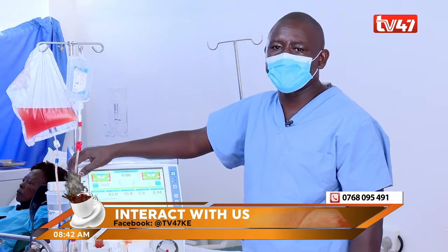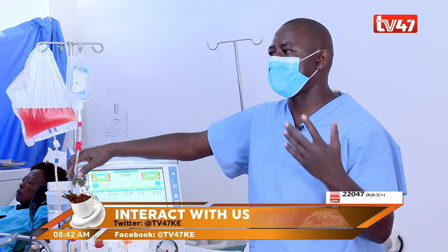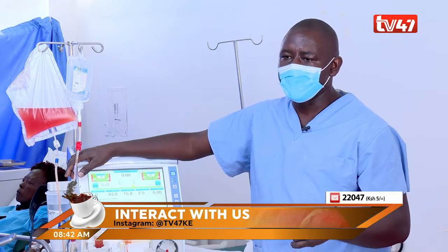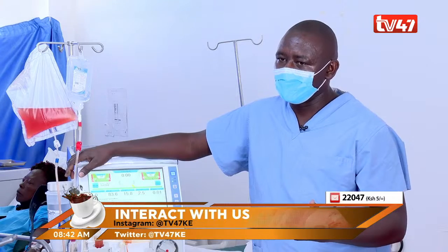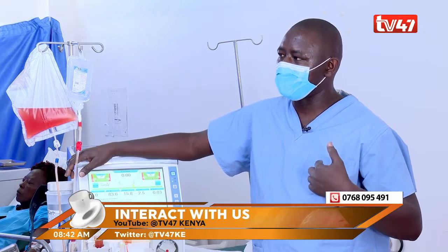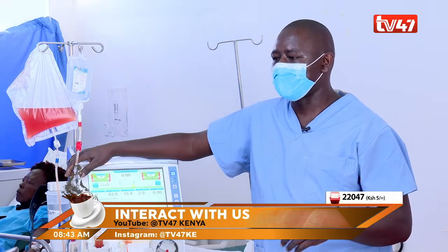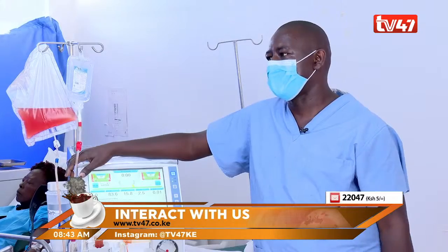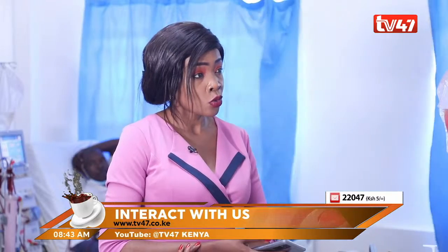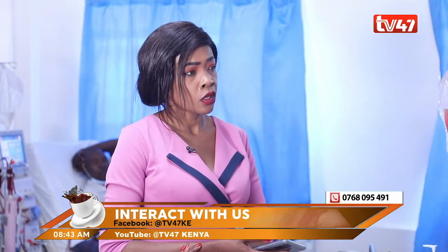When a patient is recommended by a doctor to do dialysis, first we usually encourage them to update their NHIF cards so that they can use the card to cover the procedure. Also, before we start dialysis, there is a procedure of doing what we call catheter insertion — a pipe which is inserted in the body so that we use it during dialysis. The dialysis session takes four to six hours, and the catheter stays in the body; it is not removed after each session.